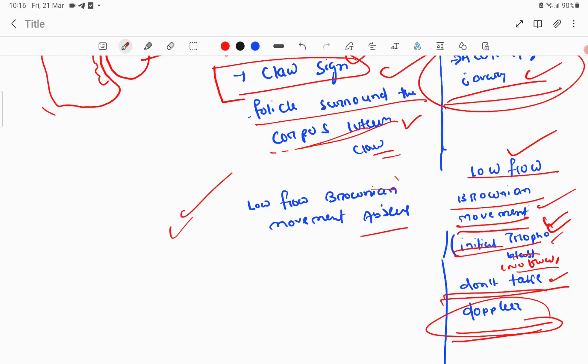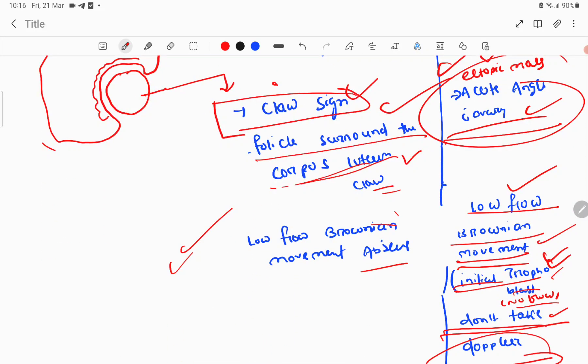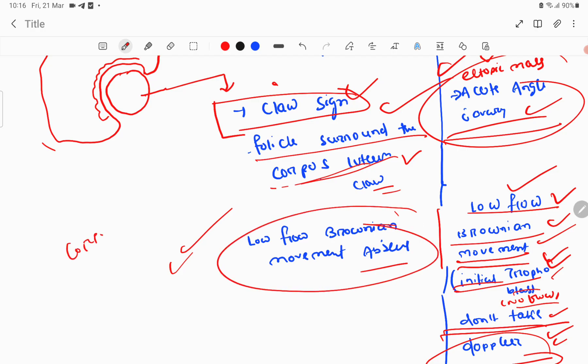Another very important and easy-to-identify sign is low flow Brownian movement. In ultrasound images, low flow Brownian movement is seen in ectopic pregnancy because the initial trophoblast does not have much flow. Do not use Doppler in early ectopic pregnancy. In corpus luteum, this low flow Brownian movement is absent.